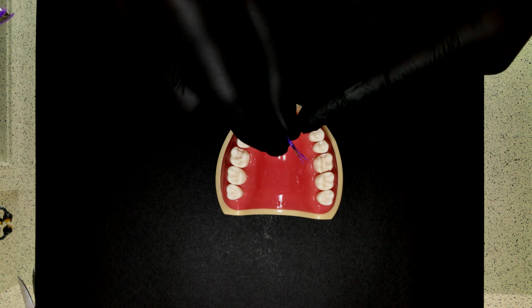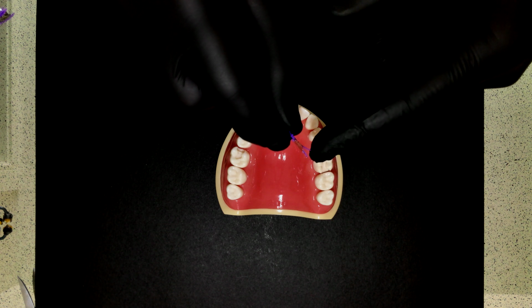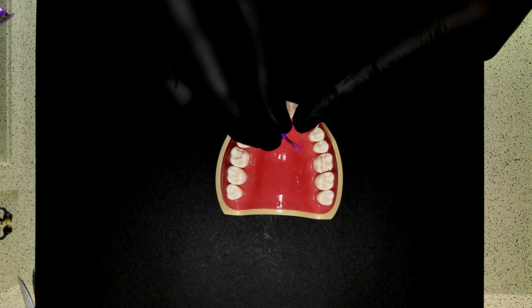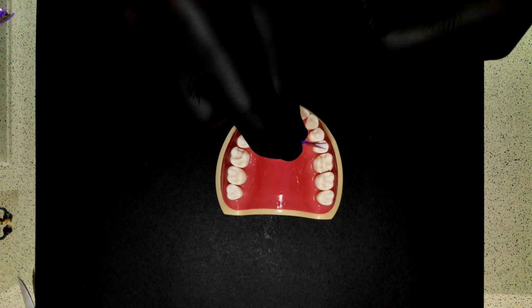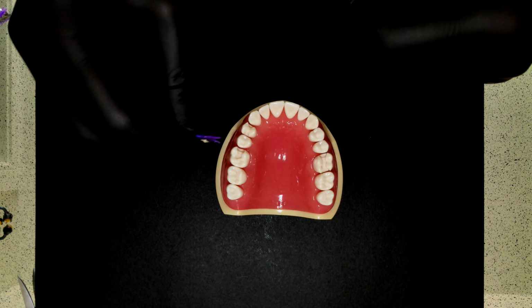There are other systems that are similar where they have a matrix band attached to a wedge, but this one has a wedge that splits in half, and that does a couple different things. One, it helps stabilize the entire mechanism when you place it. But two, it's going to allow your matrix band to curve with the tooth as you place it, so the matrix band won't jet straight out on the lingual or palatal here, and it'll help you seal that curve of the tooth.